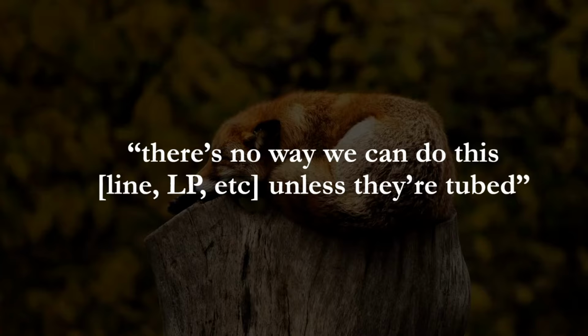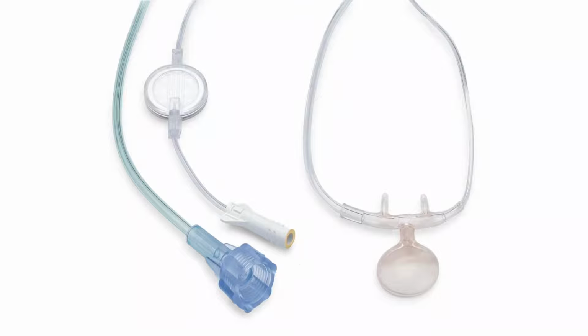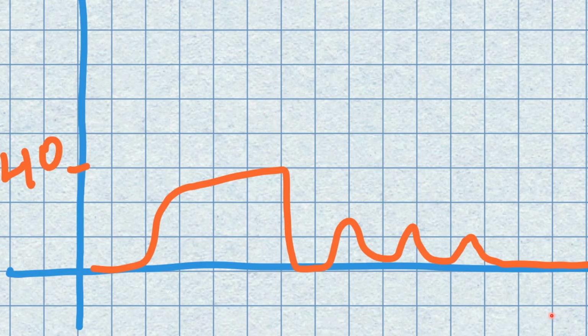At Hillcrest, I have this nasal cannula that actually has a CO2 reservoir and the detector on it. Both of these tubings are attached to the main nasal cannula tubing. This goes to the oxygen tubing, and this goes to the end tidal module. So a really worrisome waveform that I want you to be aware of when you're providing procedural sedation with capnography is this. You have initially a very nice expiratory waveform, and then you start to get these smaller and smaller blips, and this person is becoming apneic.